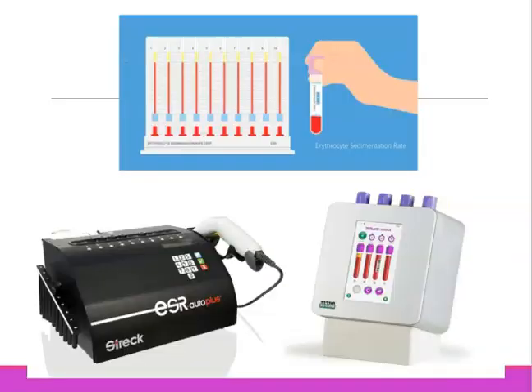Here's some images of the different methodologies for ESR testing. This top image up here shows you the manual method. We're going to take our patient samples from our EDTA tubes, and we're going to put them in these tall, thin, skinny tubes, and we're going to let the blood drop for an hour, and then we're going to measure how far it dropped over an hour, and that's going to give us our ESR reading.